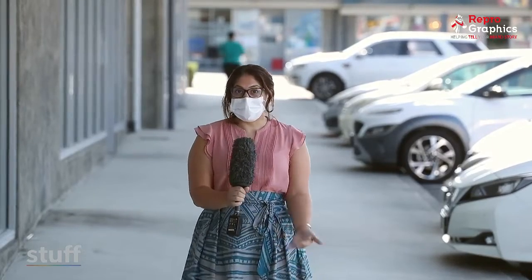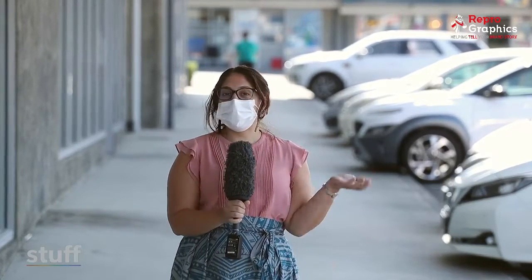Nearly all of us will need to use a RAT, a rapid antigen test, so we're here at Cavendish Doctors with Dr. Api to learn how. This is a setup for your rapid antigen test. You need a swab, you need the solution to test it in, and the kit which will tell you whether it's positive or negative.